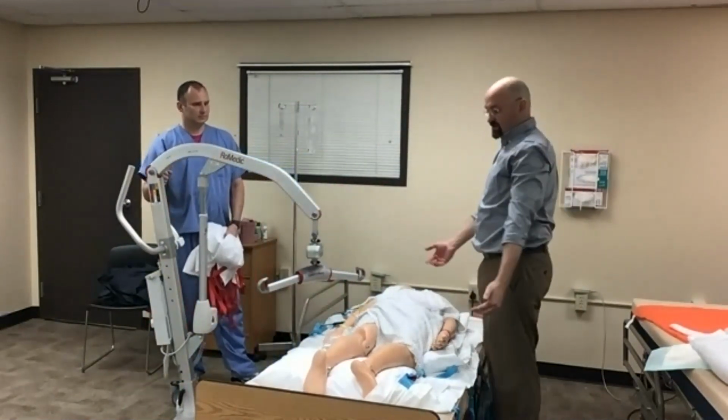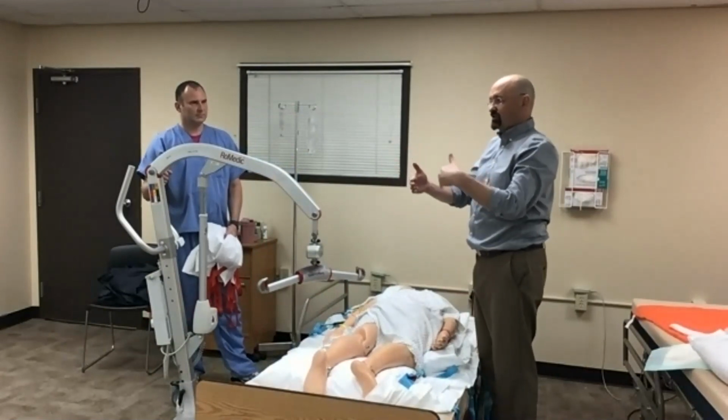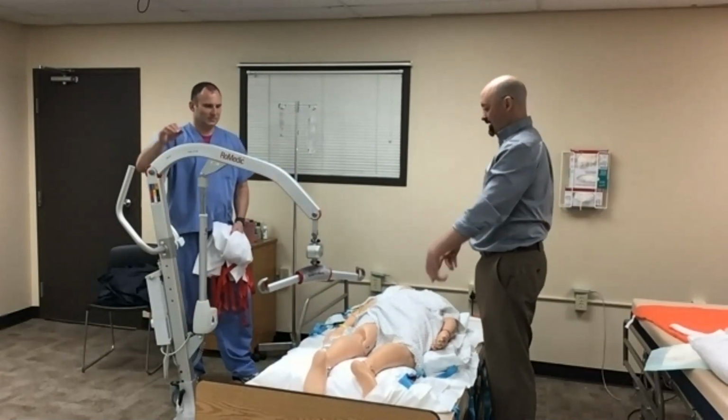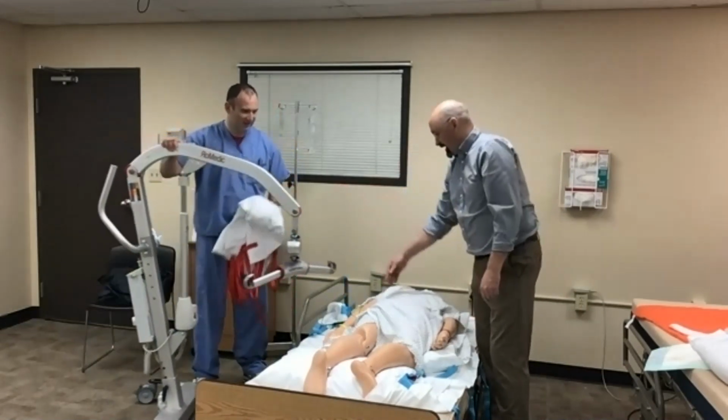What we found is, if we tried to lift him in the prone position and use that repositioning sheet, it really flexes the back and gets everything out of alignment. And their neck. So what we're going to do is hook this up as we were going to do that.